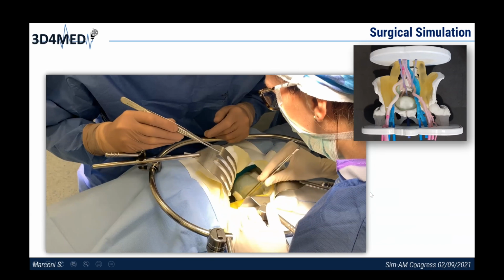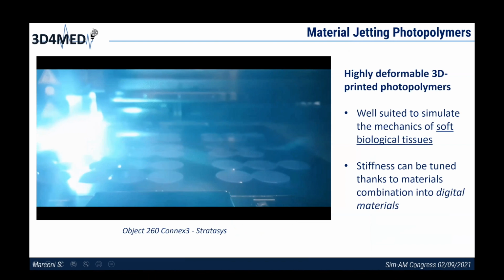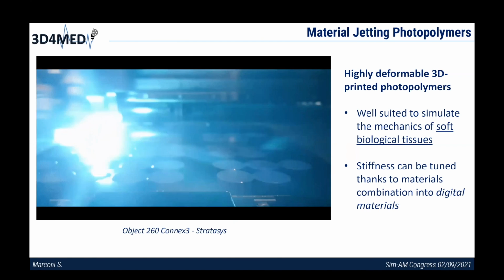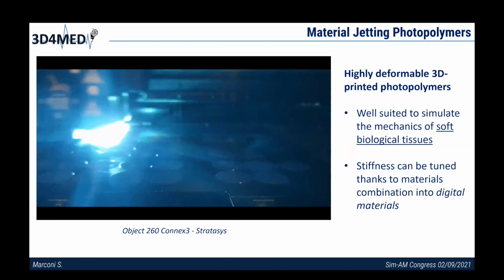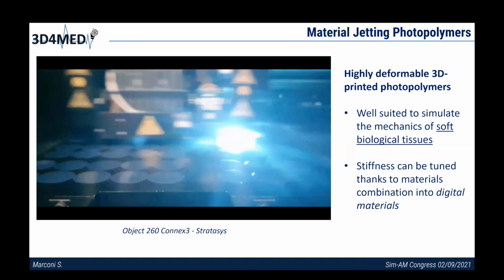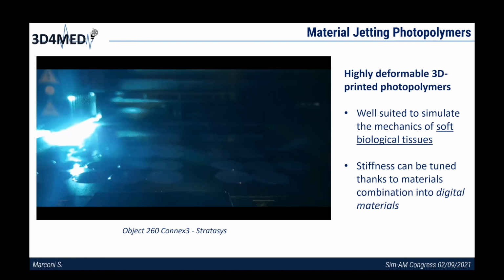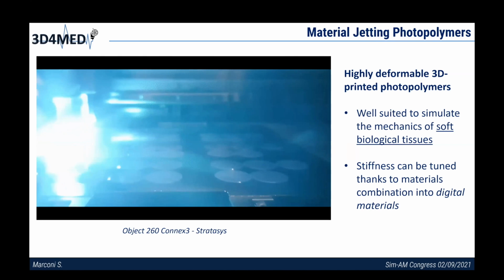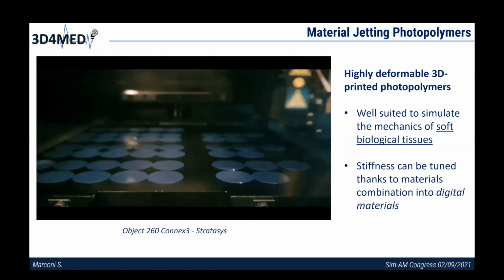Here in the video, you are looking at an entirely 3D printed platform we produced, in which we optimize from an experimental point of view the performance of the vessels for the suturing. So, given the context and given the importance of the materials for an effective training, since if the material is not very well performant, we will always have a training phase that needs to be carried out in vivo or ex vivo with all the limitation and difficulties that we know.